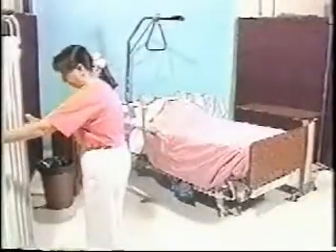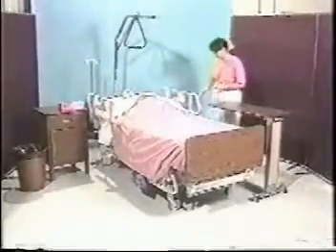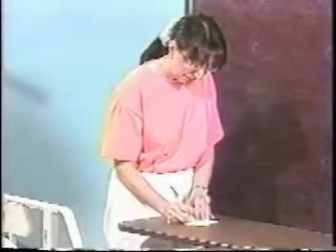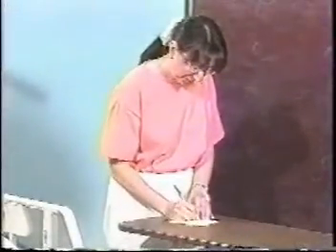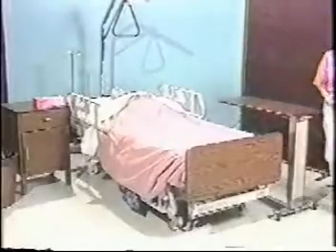Remove the privacy screen and lower the bed to its lowest position. Record the output and other findings on your notepad. Transfer the information to the intake and output record and report any unusual findings to the nurse.